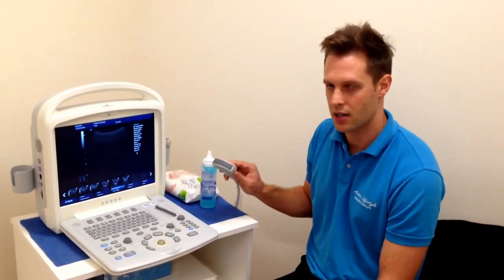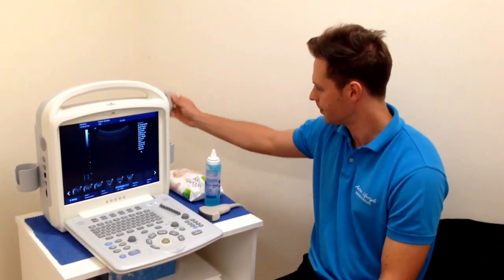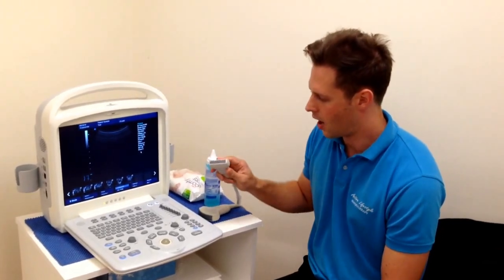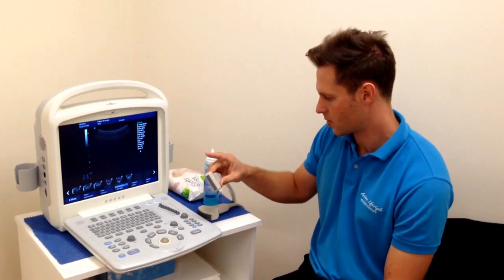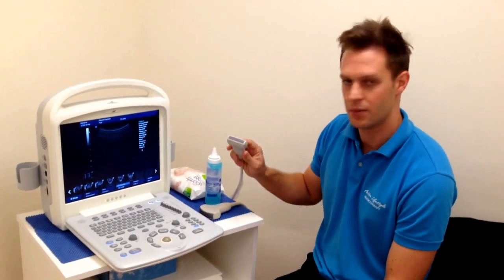What the lower frequency does is it's perhaps not as defined in certain areas, but it does have deeper penetration. Whereas the linear probe has a higher frequency — this particular one goes from 7.5 megahertz up to 10, and sometimes they go up to 15 megahertz.